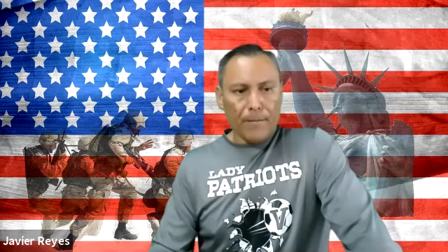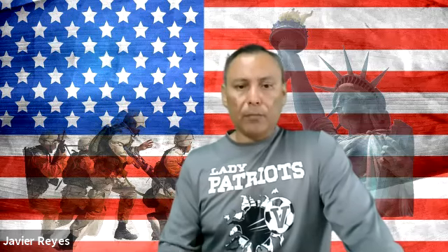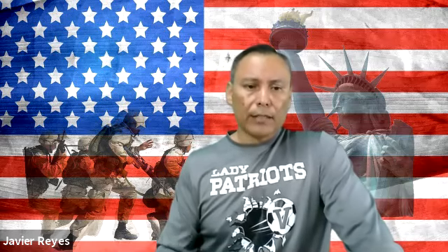Hematology specimens. You have to know about hematology, right? What color tube do you collect hematology specimens in? Lavender. Lavender is correct. All hematology specimens, studies of the blood, right? Like your complete blood count. In the CBC, you have your white blood cells, you have your red blood cells, you have your platelets, okay, and you have your different kinds of white blood cells. So those are collected in lavender, and they go to hematology.